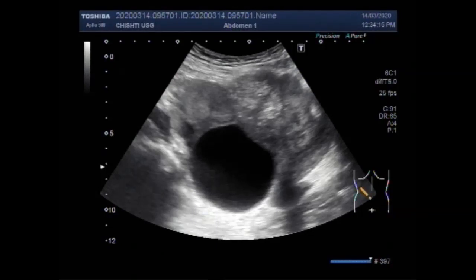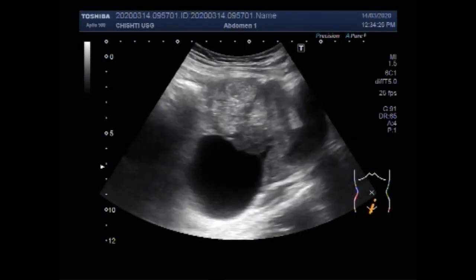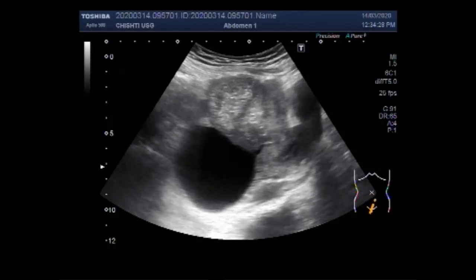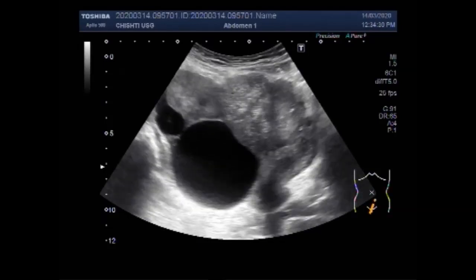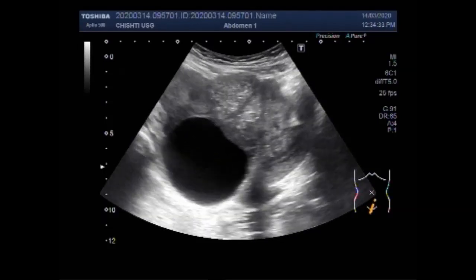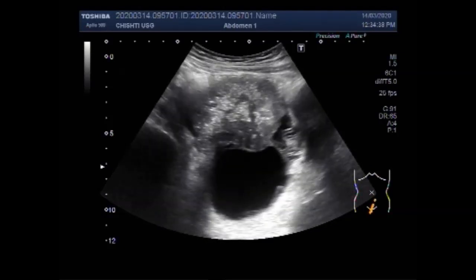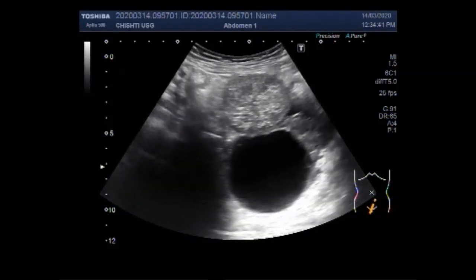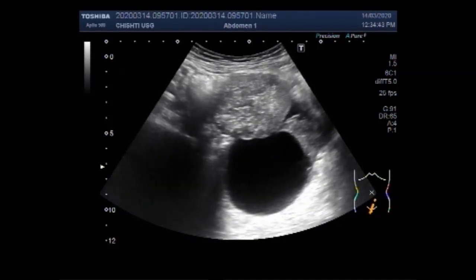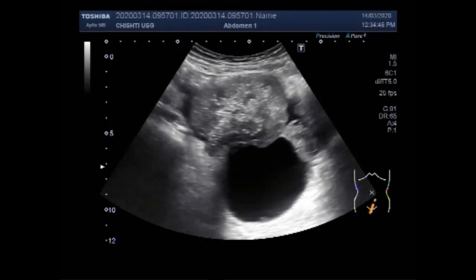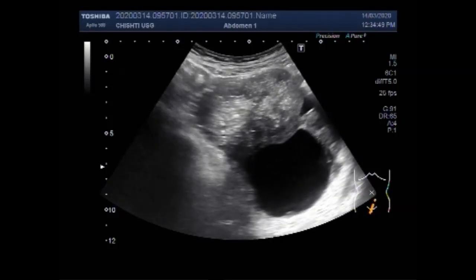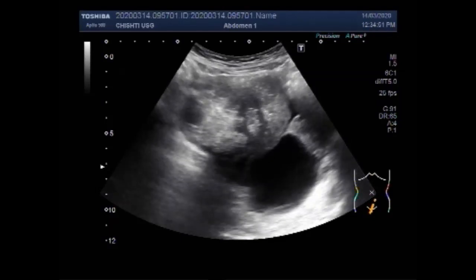Dear viewers, I hope you are all fine. This ultrasound video shows a case of metastatic ovarian cancer. You can see the uterus, a large ovarian cyst, a large uterine mass, and multiple metastatic lesions seen in the liver, which you will see later in this video.